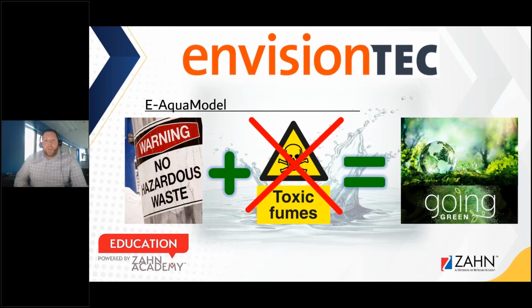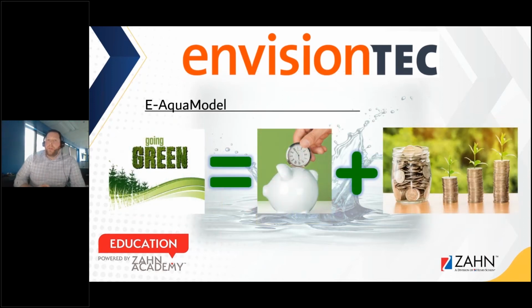So you don't have to worry about the disposal, as I said, and it's going to be more regulated as far as the cleaning goes, because we have a water soluble unit, which is going to be a little bit easier in handling in post-processing, I would think. So not only is going green a good aspect for our labs, right? We always want to go green and we always want to be helping the environment in that aspect.